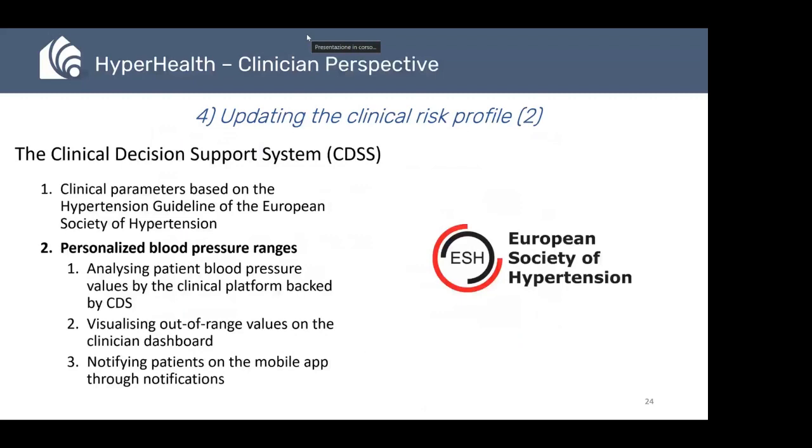The CDSS, the clinical decision support system, follows the guidelines of the European Society of Hypertension, and every time the data is updated it analyzes the values and gives back an updated set of targets.